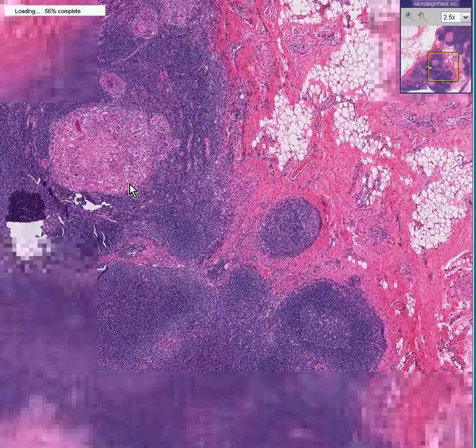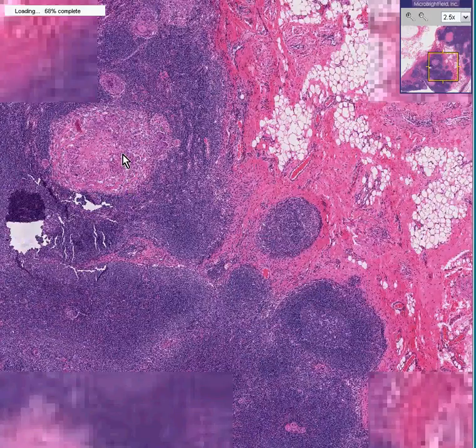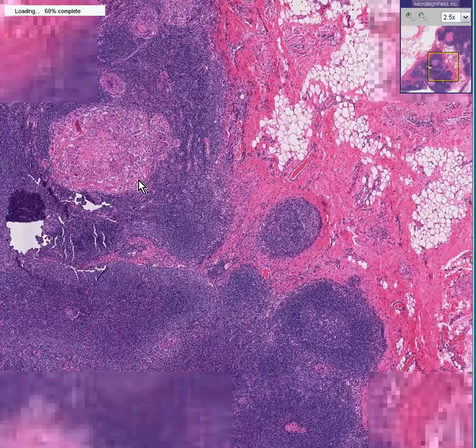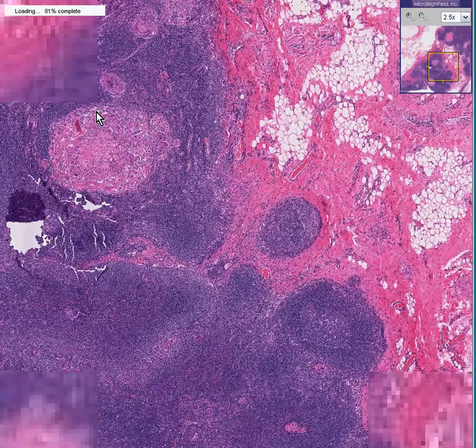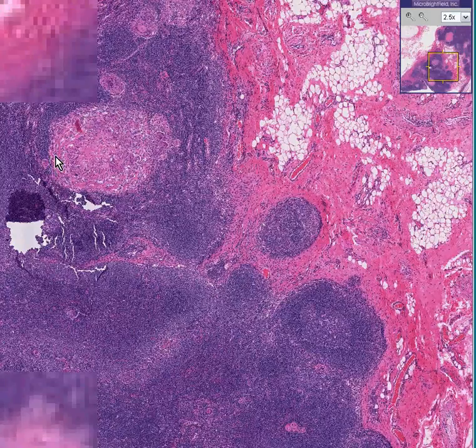Here are generally the histiocytes. You can see there's some fibrous tissue in here as well.